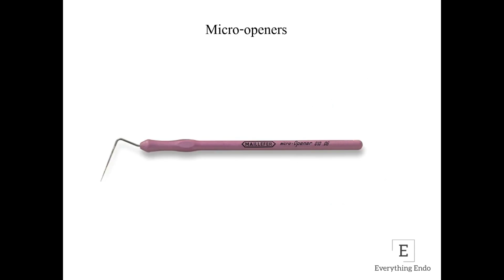Another important thing that you need to have are the micro openers. The micro openers are nothing but hand files with an offset handle.